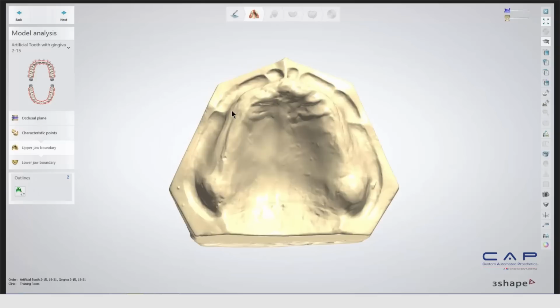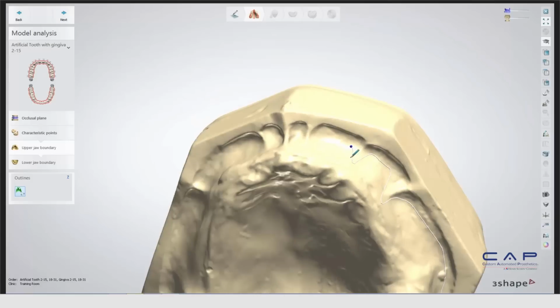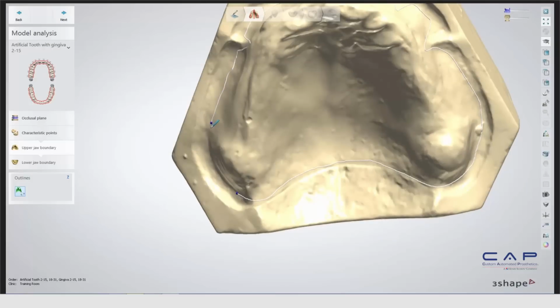Next stage is going to have us draw our boundaries. The boundary is just going to be the boundary of your base plate, so you're just going to click on this little button here, and either left click and drag to draw out that boundary, or you can do a series of clicks to customize that a little bit further. I'm just going to do a rough sketch here, just going up and around those tendons, making sure not to get it too close to those areas. We'll fix all the errors that I have there in a little bit. So just do a quick sketch first.